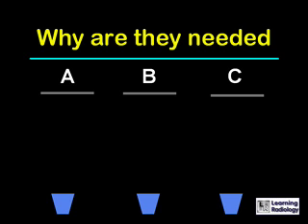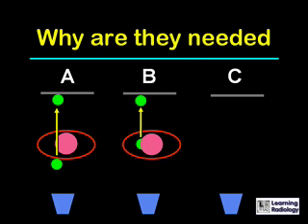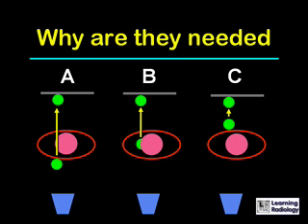If we look at three hypothetical patients, the horizontal gray lines here represent the X-ray cassettes, and the blue structures are the X-ray tubes. We're looking down on the patient's head. Patient A has a lesion on the anterior chest wall, and it projects there on their film. Patient B has a lesion that's inside the chest. It projects in the same position on their X-ray film. And patient C has a lesion posteriorly in the skin on the back, and it projects in the same location. So clearly it would be difficult to tell from just one view where this lesion was located.